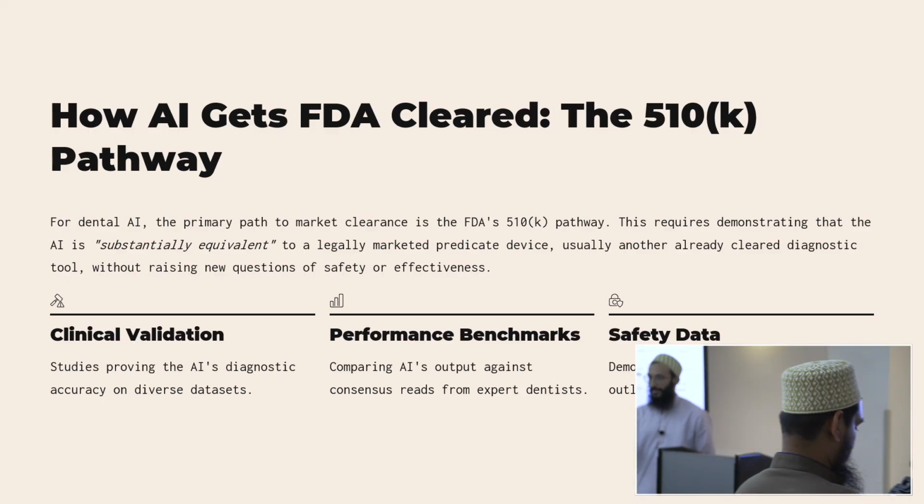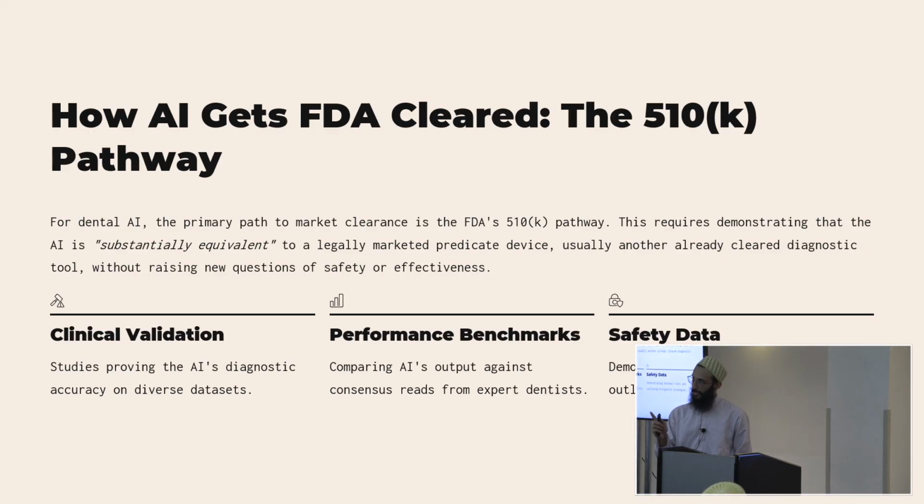So I think exposure is a little bit less important because the way the neural network works is it'll take the difference between the pixels. So exposure is really bad for human eyes, right? But for the machine, it's a little bit less important. Now, cone cuts, just a poorly taken angle, are a lot harder because it's been trained on, I think, bad images, good images, and everything just to cover those cases. But the vast majority of the images that it's been trained on have been pretty good radiographs. And hence the entire product line that says you've taken a bad radiograph, you've taken a good radiograph.